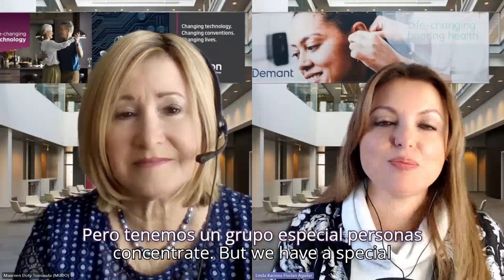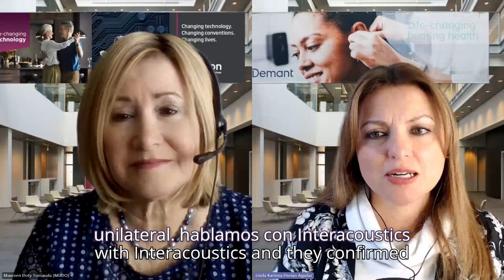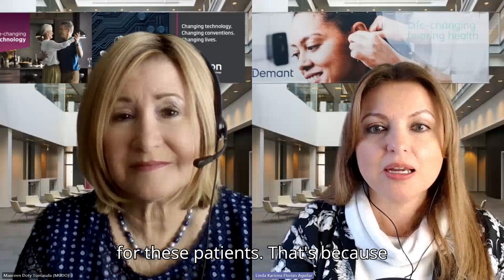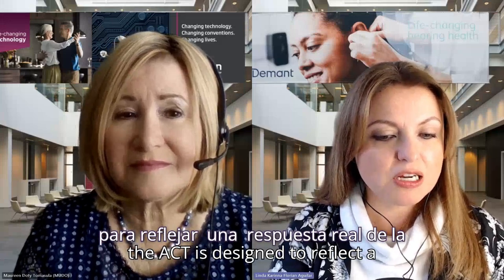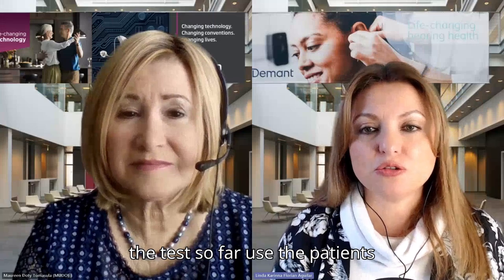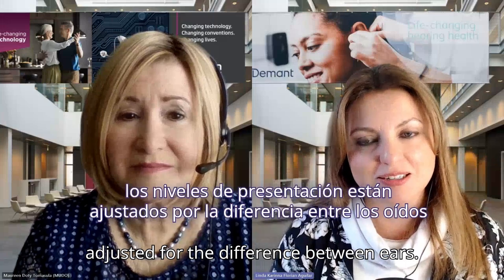But we have a special group, people with unilateral and asymmetrical hearing losses. We spoke with Interacoustics and they confirmed the test can also be performed for these patients. That's because the ACT is designed to reflect a real-world response of the patient's ability to hear in noise. Also because the test software uses the patient's audiogram, the presentation levels are adjusted for the difference between ears.